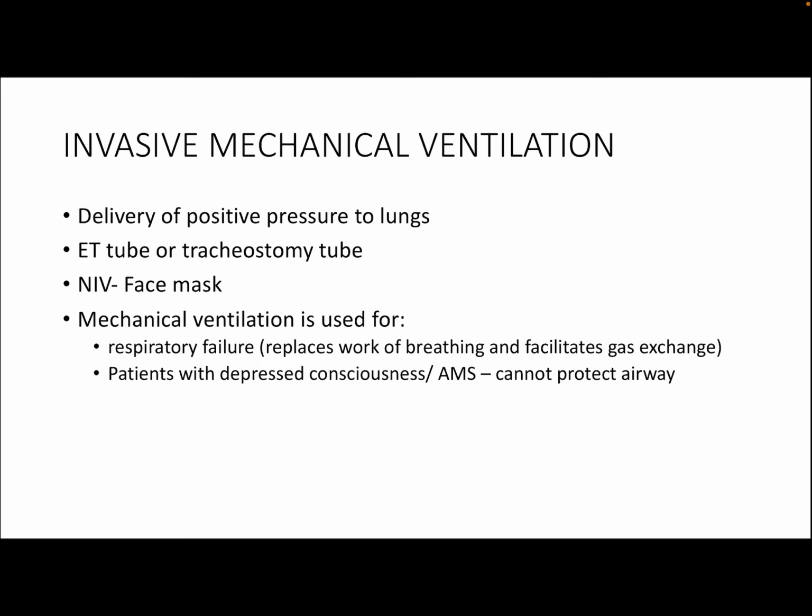So, what is invasive mechanical ventilation? This is the delivery of positive pressure to the lungs. It is done using the endotracheal tube or the tracheostomy tube. If it's a non-invasive ventilation, we use a face mask.